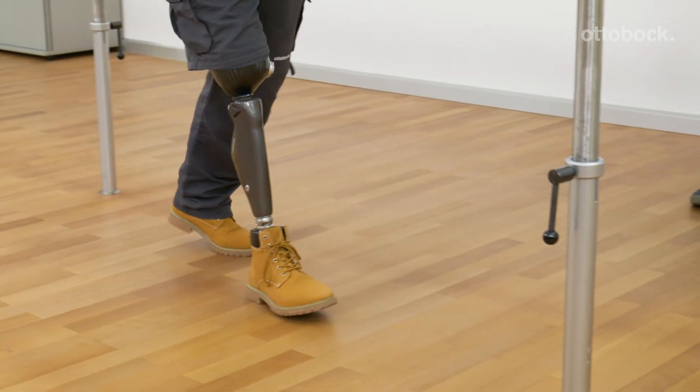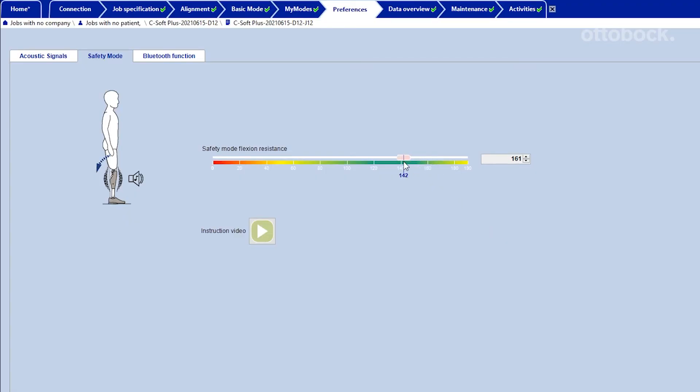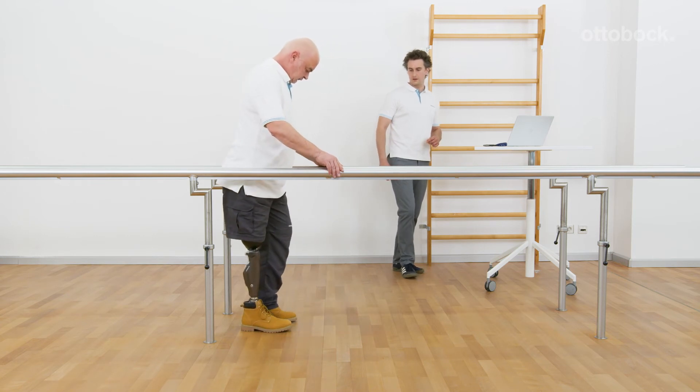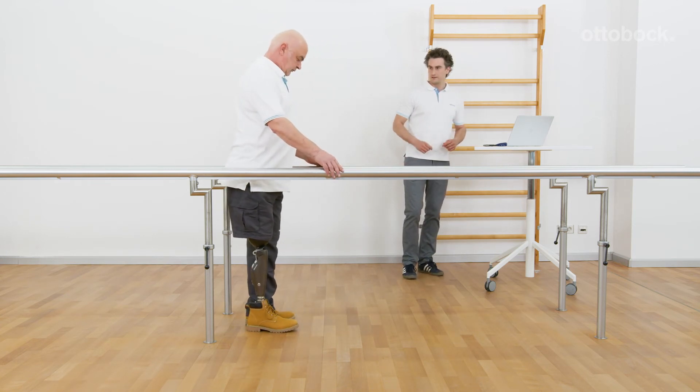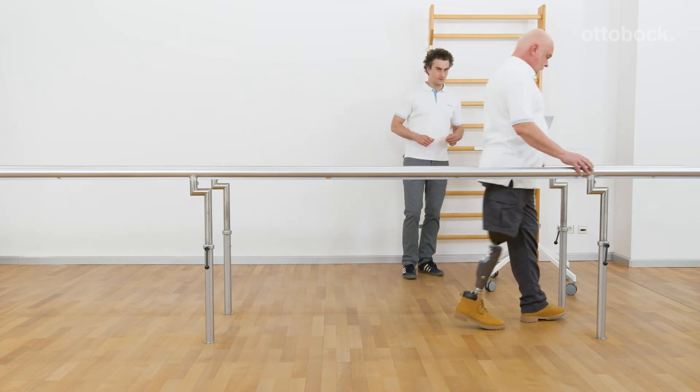The safety mode flexion resistance may be adjusted lower if the user can safely control the knee during stance and swing phase. That allows a swing-through, but the user has to strongly extend the hip with the residual limb to avoid uncontrolled knee flexion in stance phase.